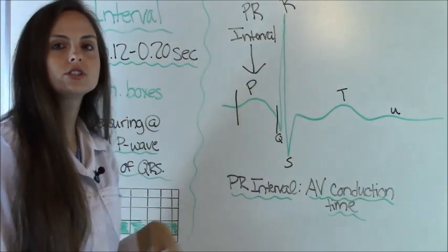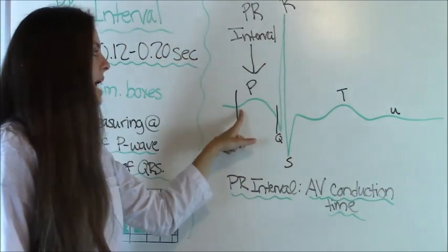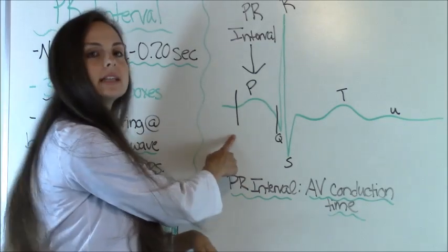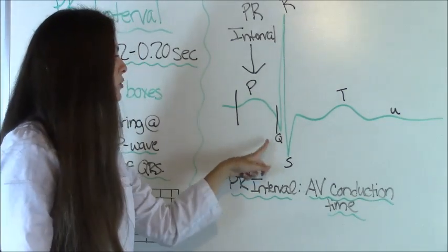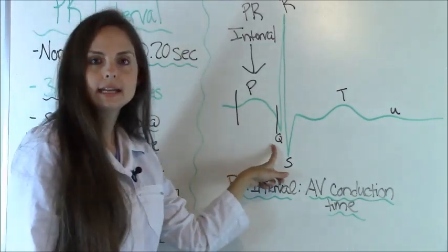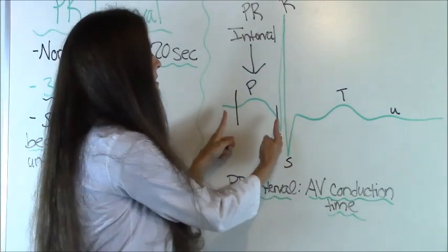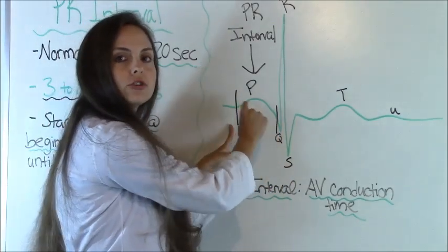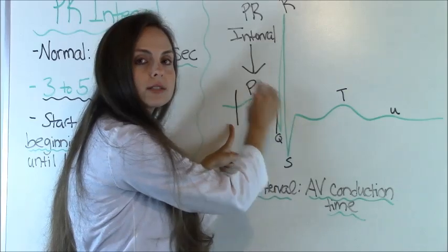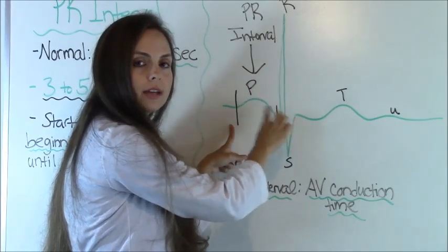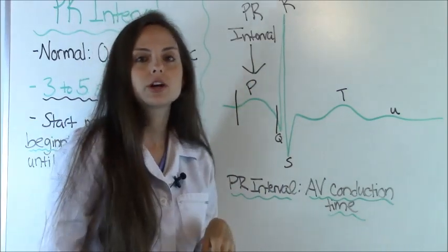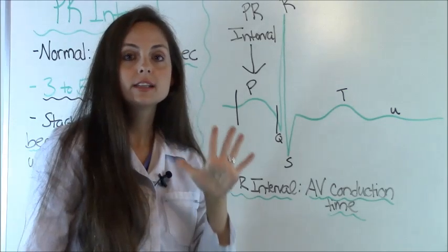So when you measure the PR interval, you're going to start at the beginning of the P wave, which is represented by this line here. And you're going to stop at the beginning of where the QRS starts. So you'll be measuring from here to here. And when you're measuring, you're looking at your small blocks, which is the background blocks behind the EKG strip, and making sure that it measures between 3 to 5 blocks.